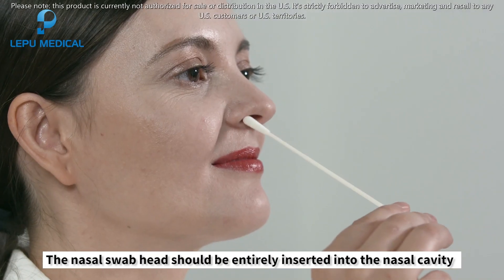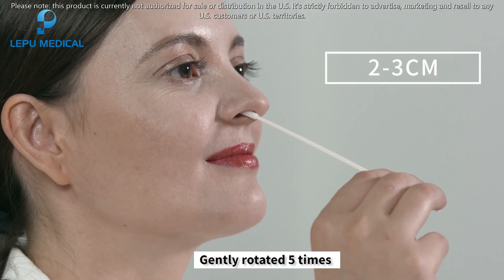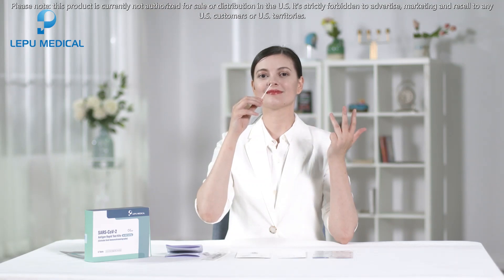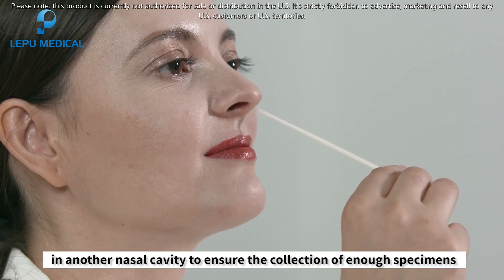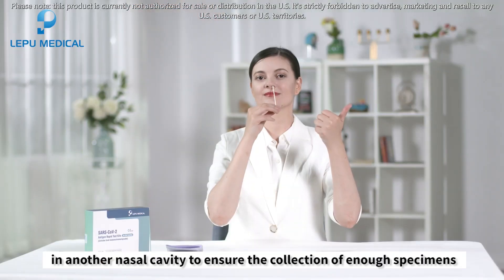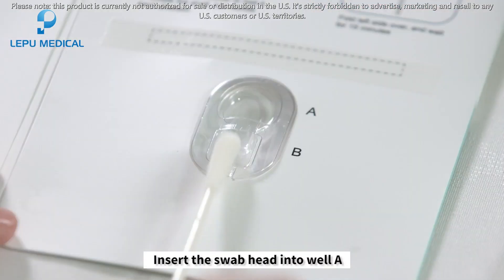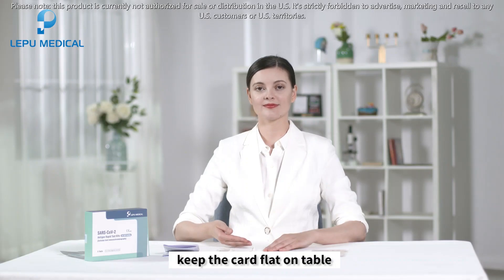The nasal swab head should be entirely inserted into the nasal cavity about two to three centimeters and gently rotated five times. The specimen should be taken in the same way in the other nasal cavity to ensure the collection of enough specimen. Then insert the swab into well A from the bottom of well B, keeping the card flat on the table.